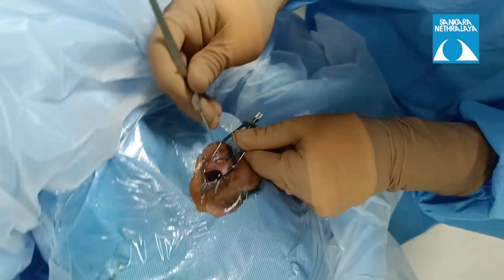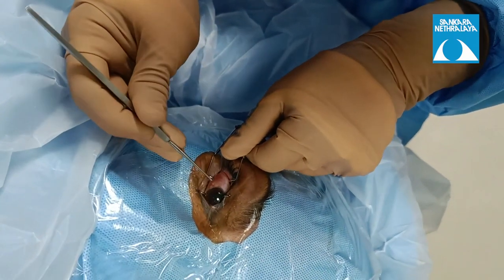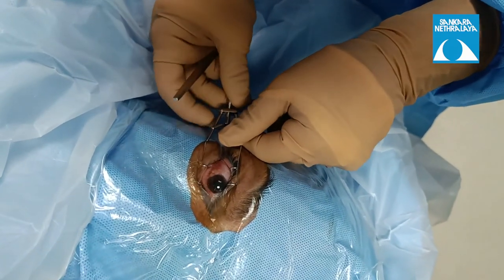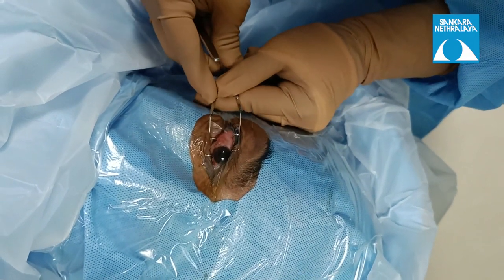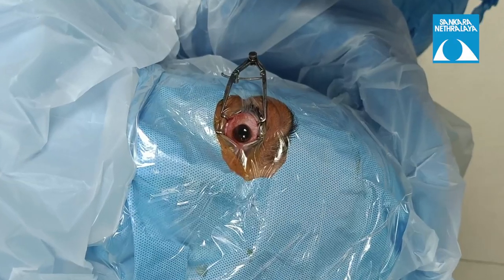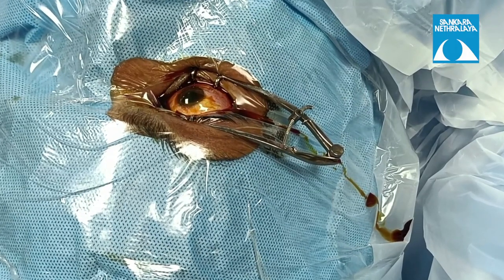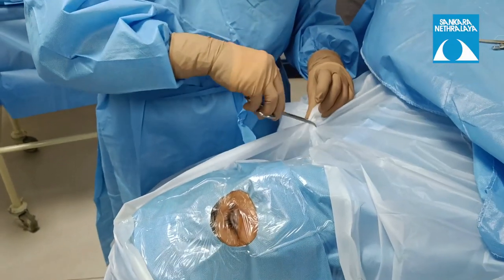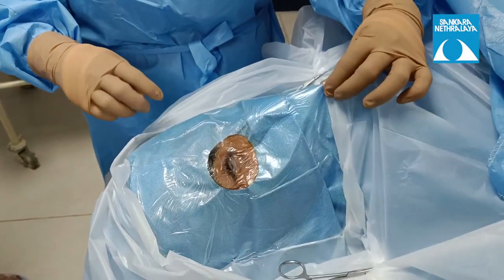The speculum is placed with the drape covering the eyelid margin so that all eyelashes are well covered. In case eyelashes come out, they can be rolled inside using a muscle hook to keep the surgical area clean. Make sure the cornea is kept well moistened using normal saline or a viscoelastic substance once the speculum is placed.